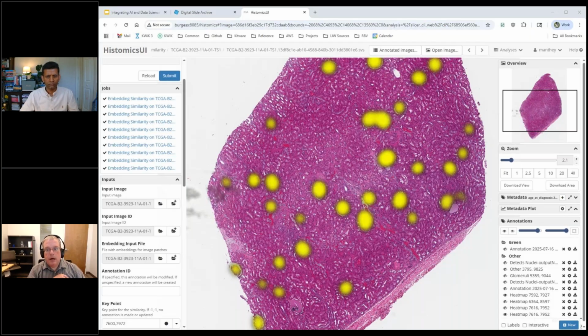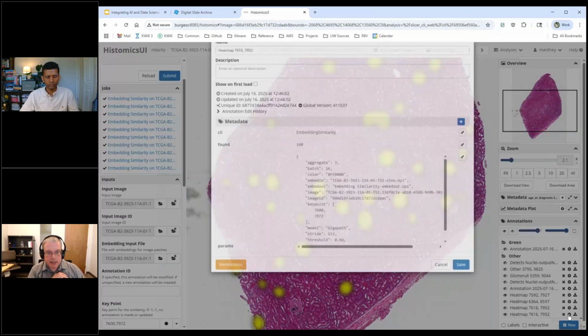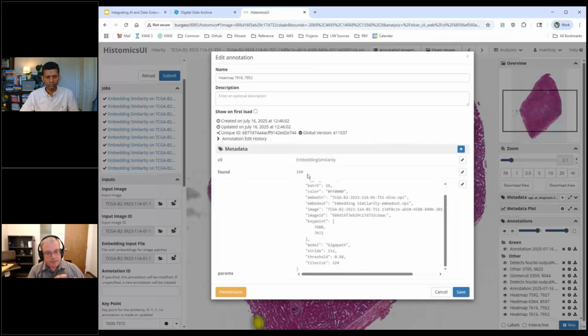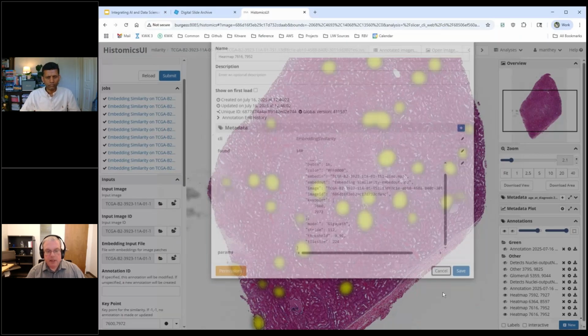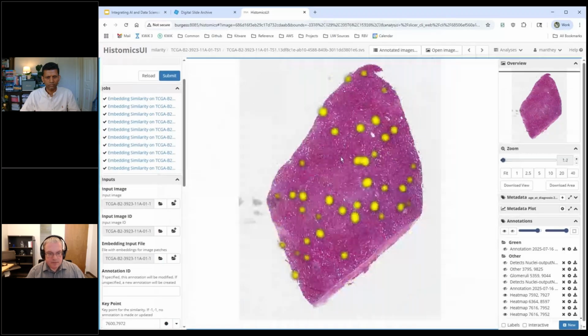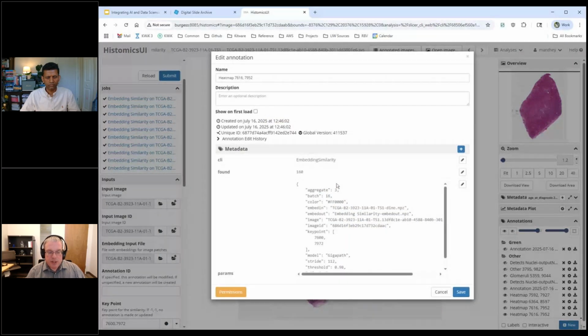Currently, there isn't a great way to look at the textual description here. I do see some data, like the parameters that were used, and it tells me it found 160 areas, individual points. To be clear, this might be four or five points in it, but the number of points it found positive signal on was 160. That may or may not be useful information, but you can have your algorithm output things. So we could have a whole text block here or somewhere more convenient. This is just a default way to look at it, and so yes.